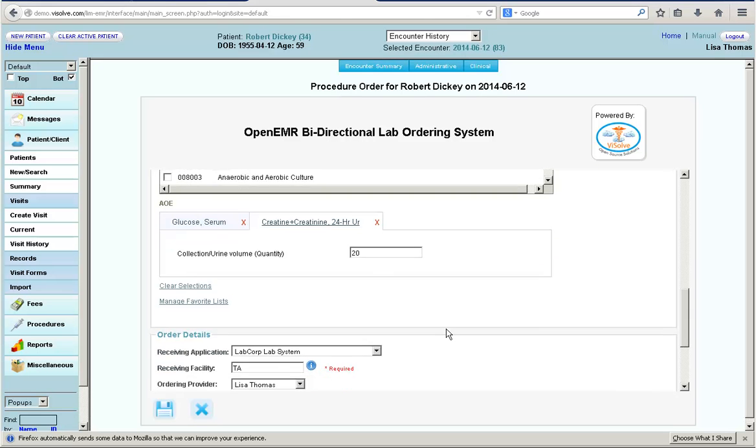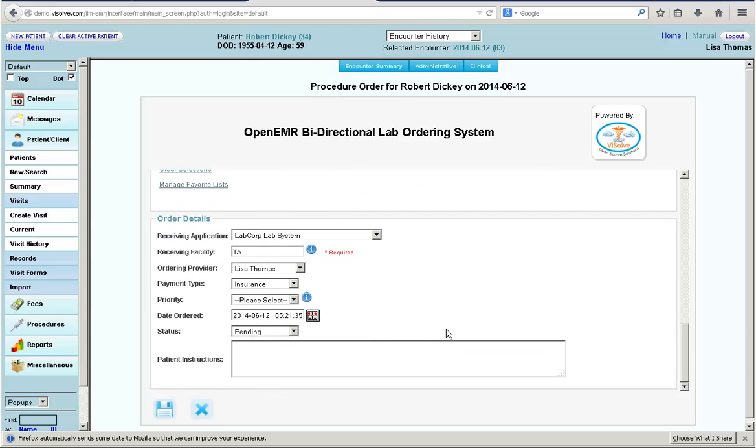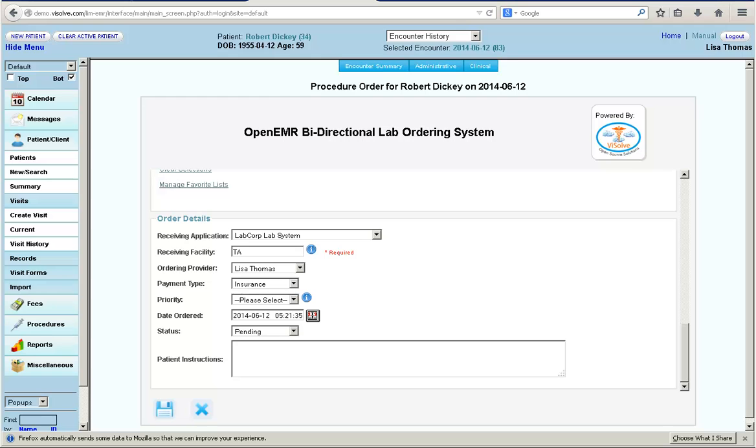Once lab test details are entered, Dr. Lisa sees the order details section. The information for receiving application and receiving facility will be provided to Dr. Lisa when she sets up connectivity with the lab. The other information like ordering provider, payment type, date ordered, and status will be auto-populated.